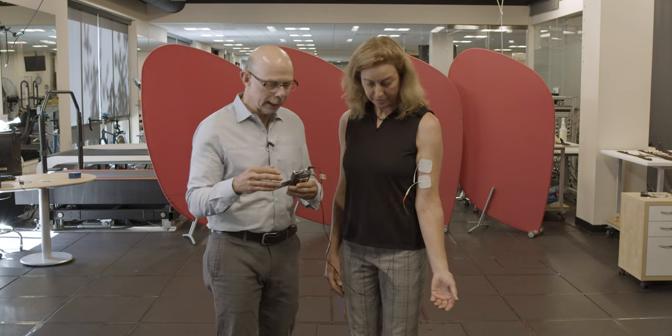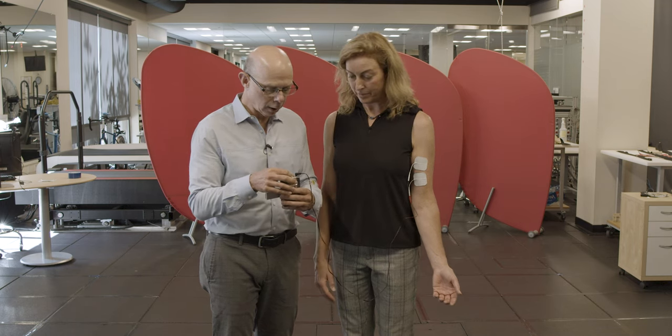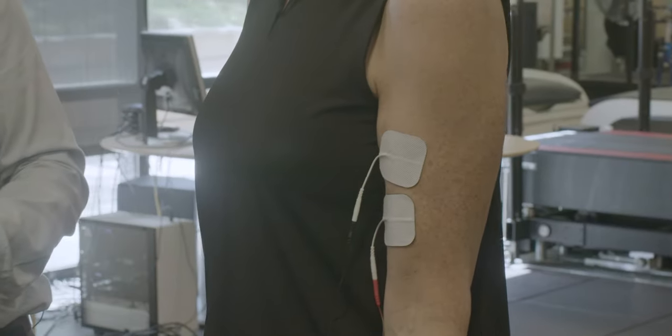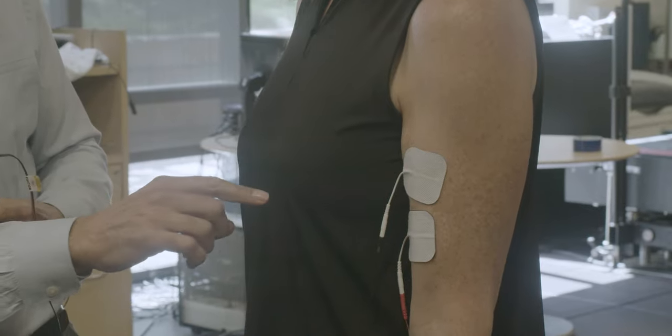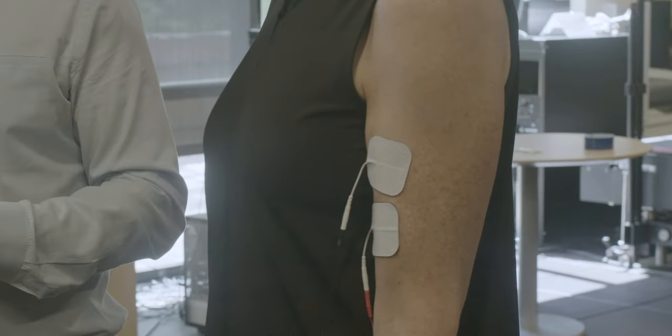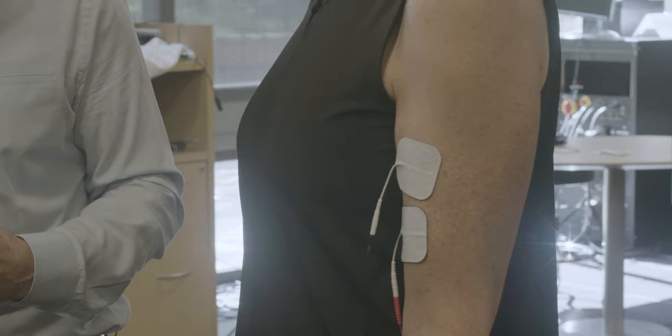The stimulator is off and it's at two hertz. I'm going to turn it on and tell me when you can begin to feel the stim. She could feel it, and we're beginning to get a two hertz excitation of her biceps muscle. And you can see that two hertz twitching.